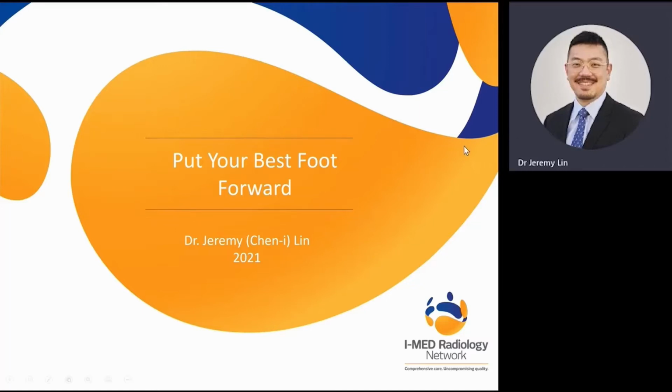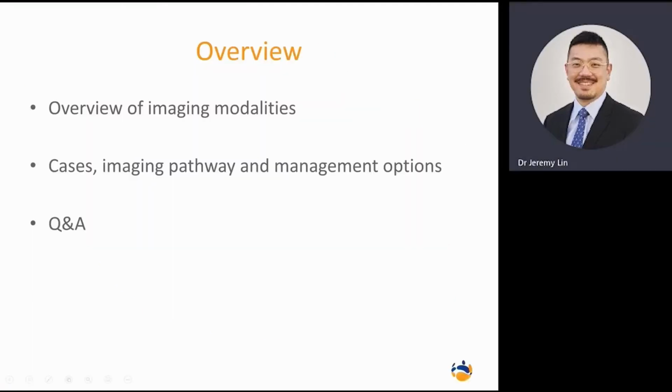So what we're going to go through tonight is an overview of the potential imaging modalities that we use in assessing problems around the ankle and foot. I will also go through some cases and imaging pathways as well as management options for those cases.